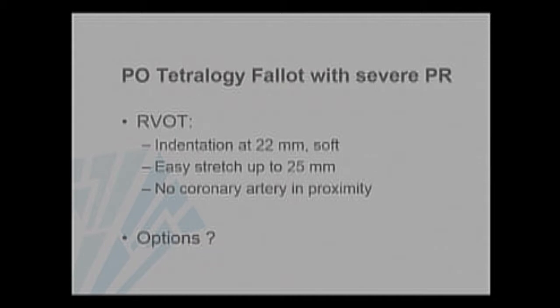I think there can be some options. The pre-stenting with some balloon expandable stent, and then put some adult valve, or the Venous P valve, if available, can be a good option. For the balloon expandable stent, what size balloon would you mount the stent on, and what type of stent? So the extra large size stent, any type is okay.